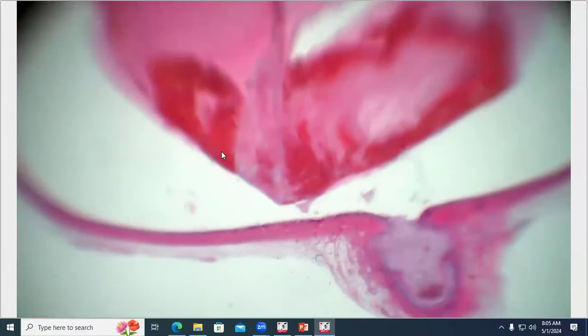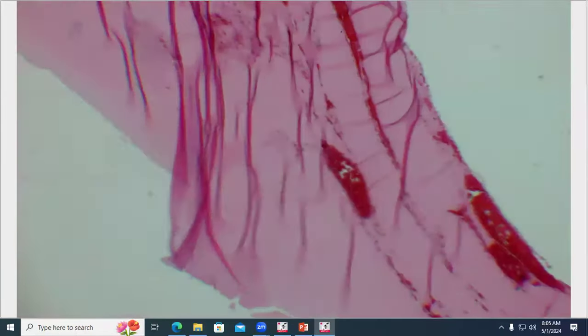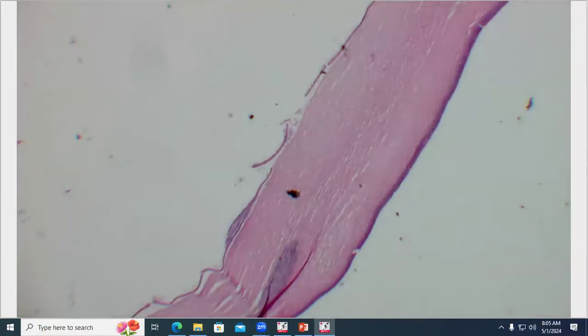And we can see our optic nerve head and then detached retina, which is kind of artifactually shifted to one side, but here it is coming out just like we saw in our gross view. Let's take a look at this globe a little closer than that. So to orient you, we've now rotated the globe 90 degrees clockwise. Our cornea is on our right.